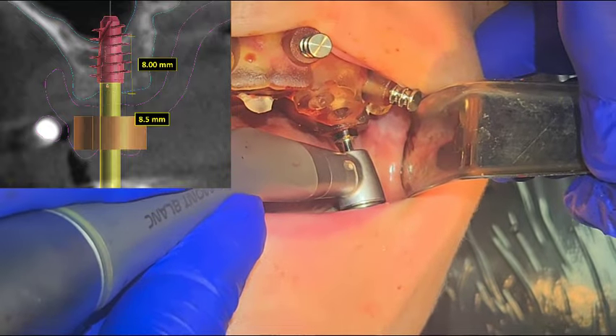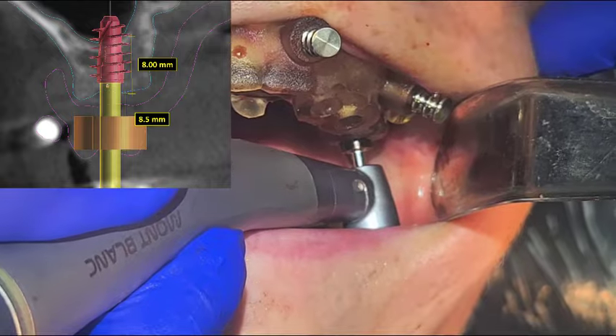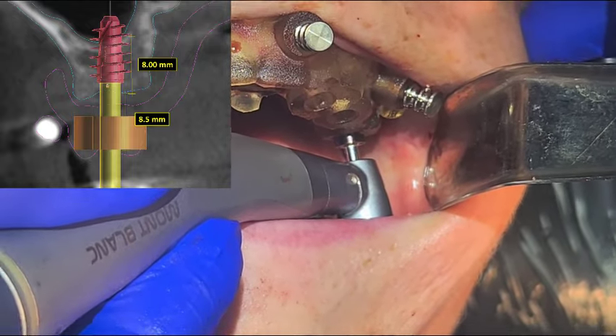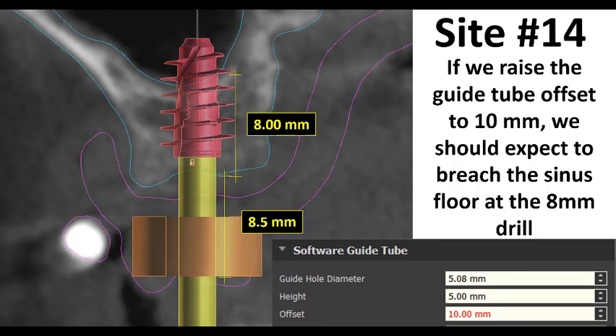Here's how you check for patency. Aaron felt like he may have broken through with the 8 millimeter drill. So he takes the next drill — the 9mm — and puts it in without even running it. You can see here it's going all the way to depth. That tells us it's patent and we can do the graft. After raising the guide tube, we expected to break through at eight, and he kind of felt that pop as the 8mm drill was breaking through the cortical floor of the sinus. Couldn't tell for sure, so he grabbed the 9mm drill and without running it, it slid all the way to depth. There's no risk that Aaron's pushing on the membrane more than that one millimeter of extra length on the drill — not enough to damage the sinus membrane. That tells him he's patent and he can begin his lift.